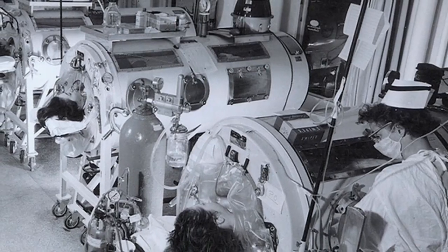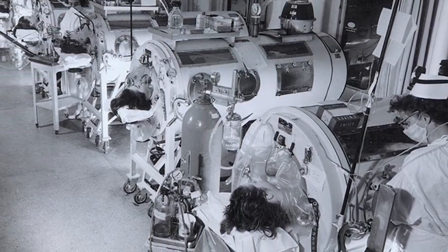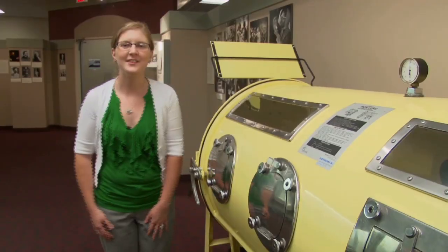During the polio epidemics of the 1940s and 50s, American hospitals had wards full of polio patients and iron lungs. So let's turn this thing on.